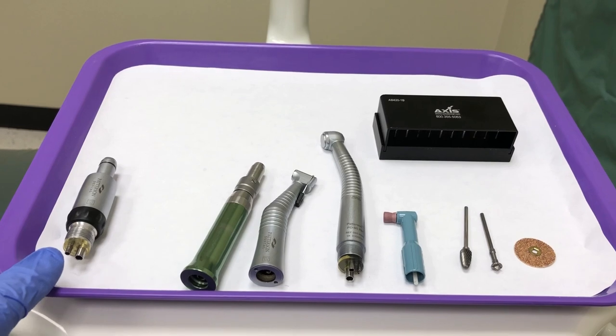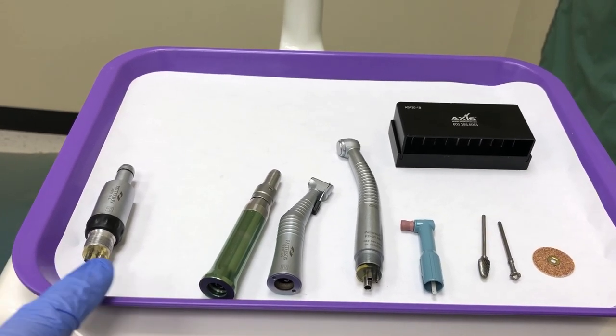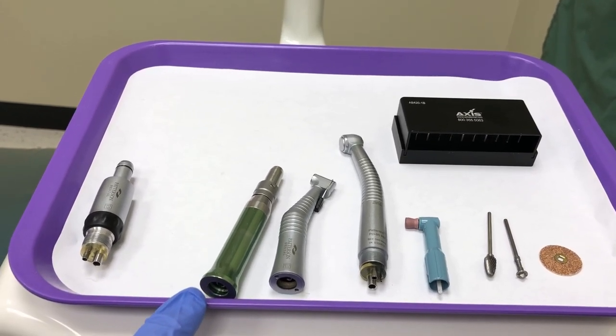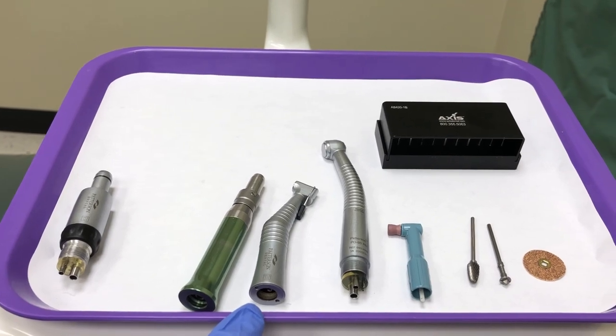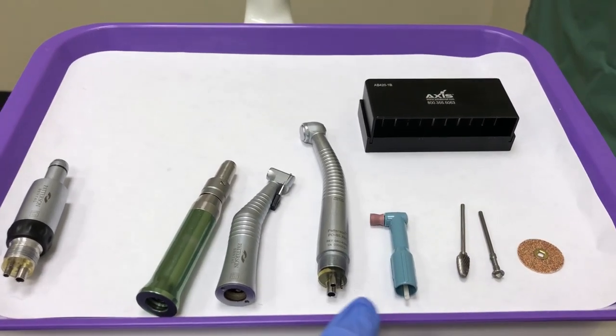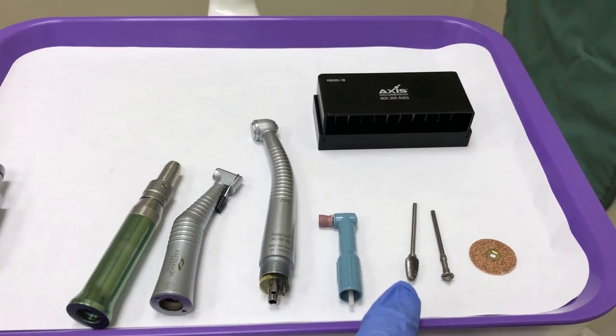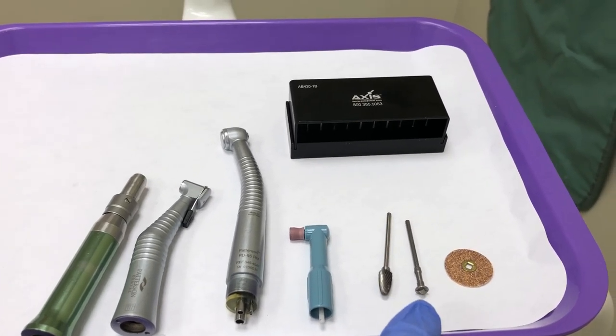On your tray, you have a low-speed motor, a straight attachment, a contra angle, a high-speed handpiece, a prophy angle, a laboratory burr, a mandrel, and a disc.